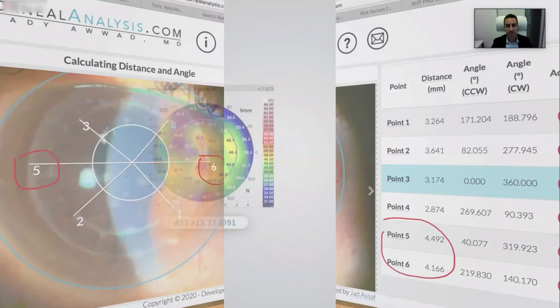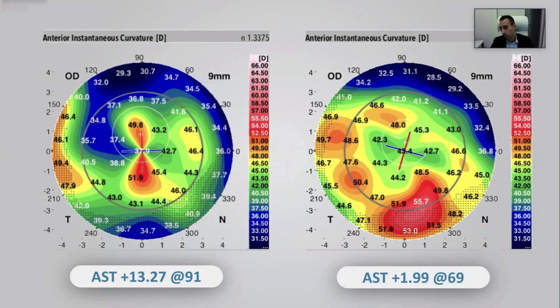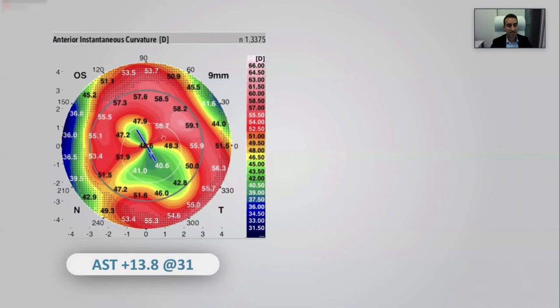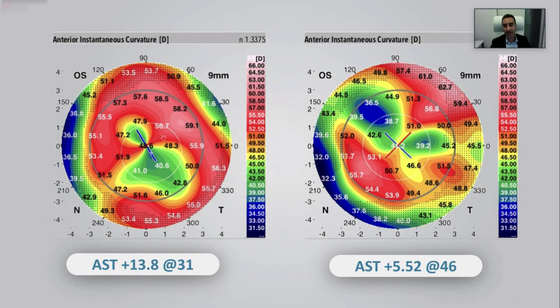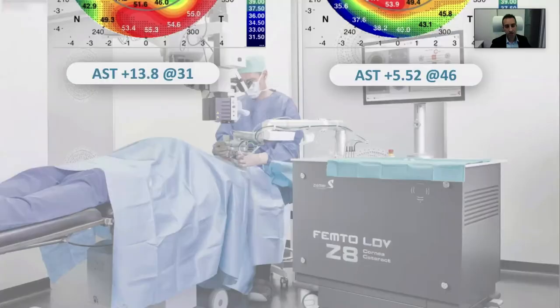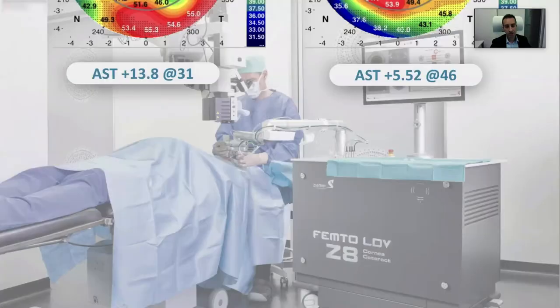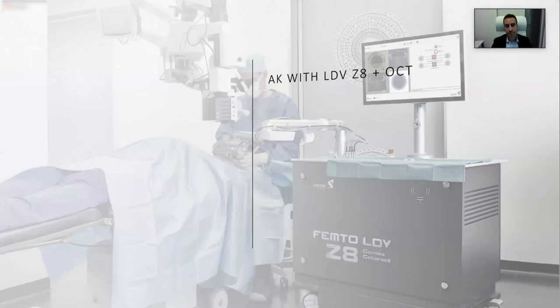A few cases: a 13.27-diopter more-or-less symmetrical bowtie — after debulking, reduced to 1.99 diopters: a happy patient. A more interesting case with significant irregularity, likely due to differential stromal and subepithelial haze: 13.8 diopters, very irregular, with a flattening bowtie. A perfectly nice result is not expected, but it came down to 5.52 diopters, now amenable to topography-guided laser. That exemplifies the concept of debulking and fine-tuning with a different technology later. In conclusion: femto-AK with the Z8 with intraoperative OCT is safe and efficacious, especially when going deep, and serves the purpose of debulking. Fine-tuning with excimer, phakic IOLs, toric IOLs, or even spectacles can follow. Thank you.